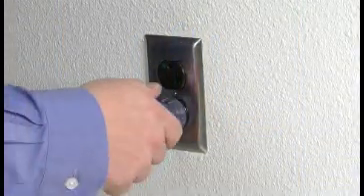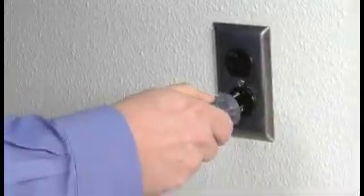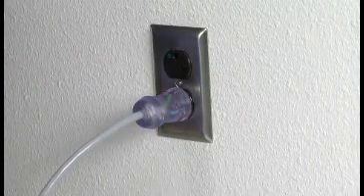To prevent damage to the plugs, properly connect or disconnect the wall plugs by grasping the body, as demonstrated, not the cord.